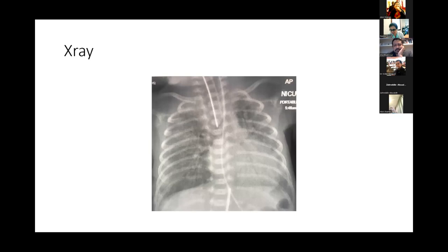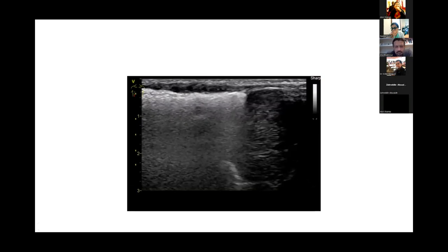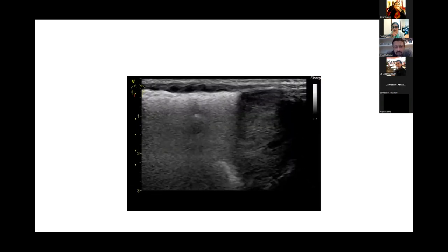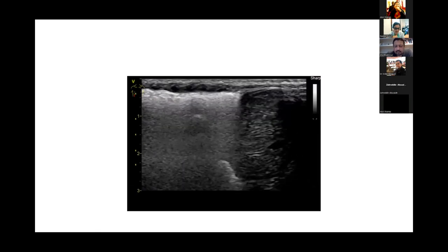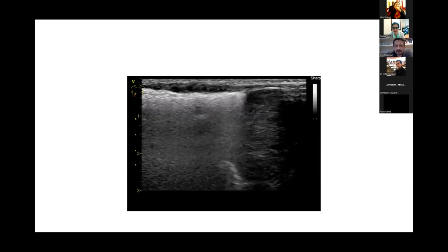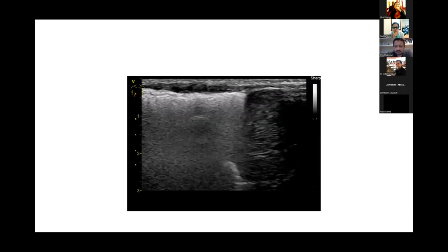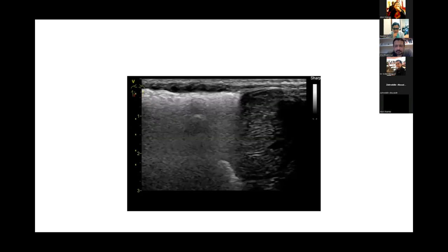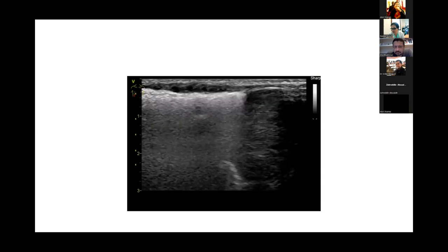So, what would you expect to see on the ultrasound scan? Going back to the image where you asked, could this be compatible with PIE? Well, I don't know. I totally agree that this occurs in bad lungs, lungs with chronic disease changes where you would have areas that are non-aerated, definitely. You would have areas with B-lines, for sure. You would have a thickened, irregular pleural line, yes. But in the area with emphysema, you would have areas where you would pick up air, right?